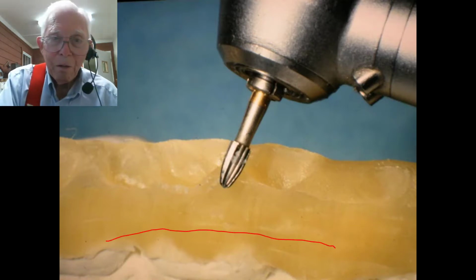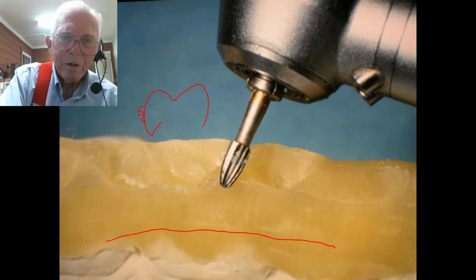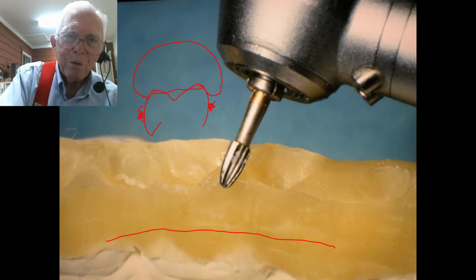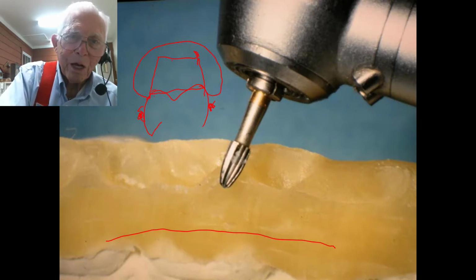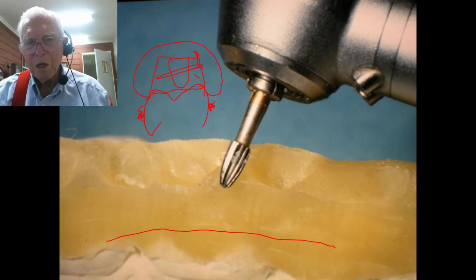You've got a tooth up here like this, and you've got brackets and everything over on the sides of it like this. When you first put it on there, it kind of folds out over like such, and you press down with the teeth, and now you take something and cut it off right like this, and then when you get ready to take it out, you go down like this, press it together, and it'll come off the teeth.